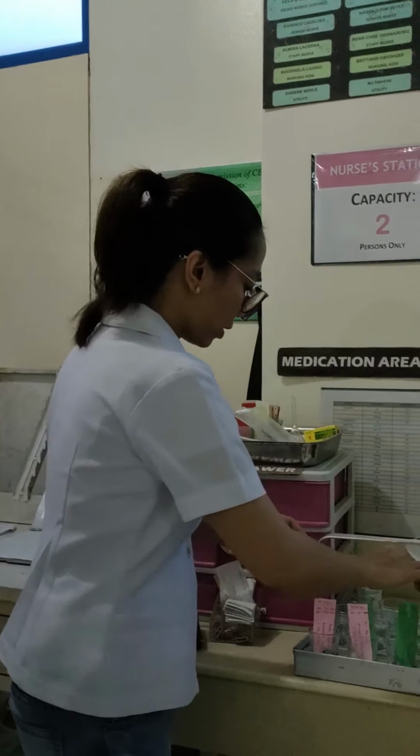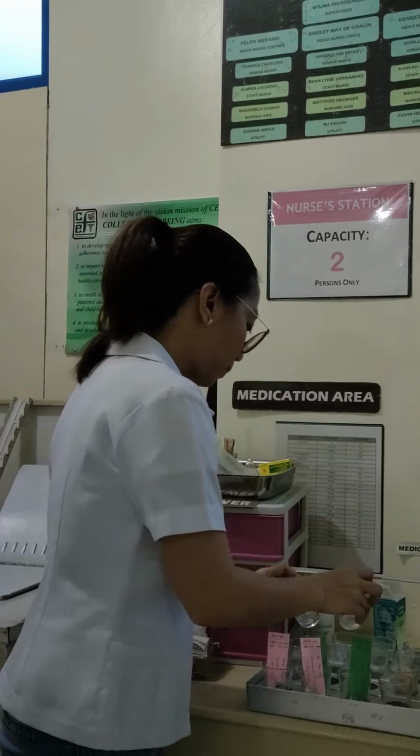Continuation of the preparation of the oral medication. In case your patient has difficulty swallowing, we may use a pill crushing device to help the client swallow the medication. Or if there is none, we can use two medication cups here, and we'll be able to pulverize the medication.